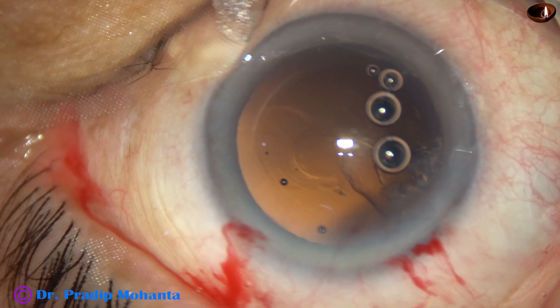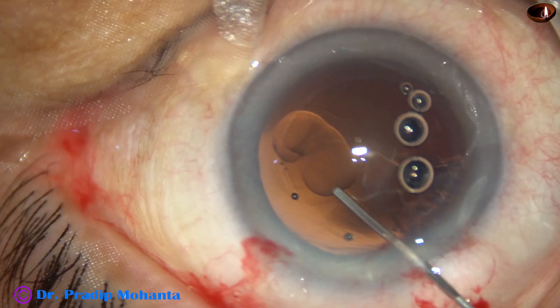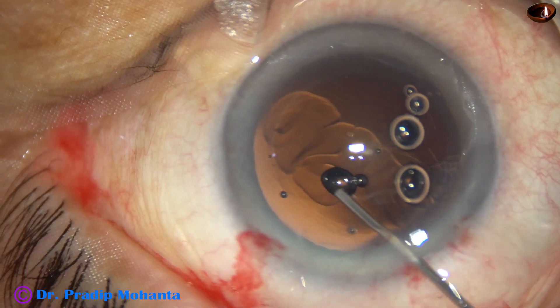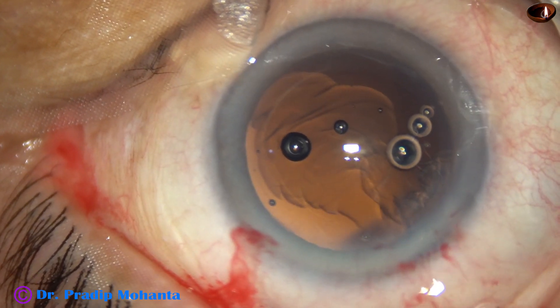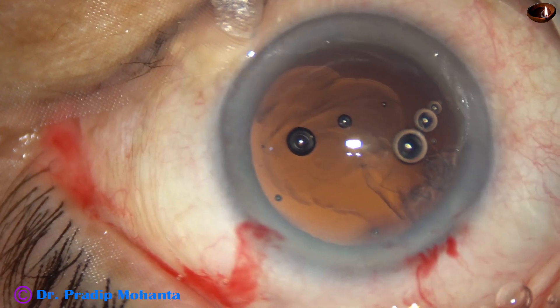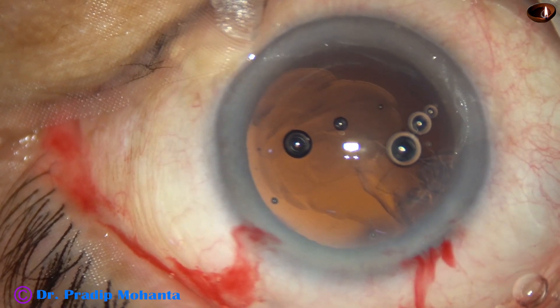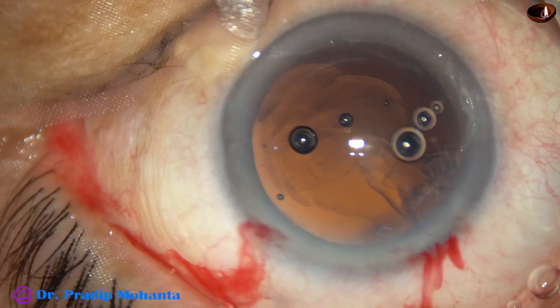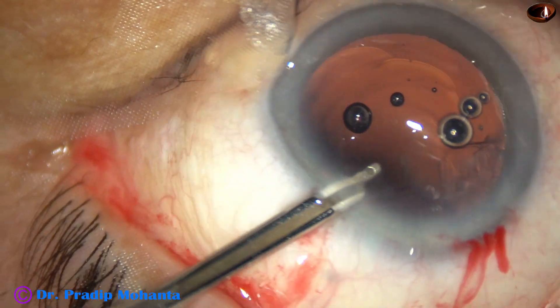This is a small rent and I will be able to place the lens in the bag. This is Viscoat from Alcon — it nicely clogs the rent. Now I do dry aspiration of the cortex at 10 o'clock.